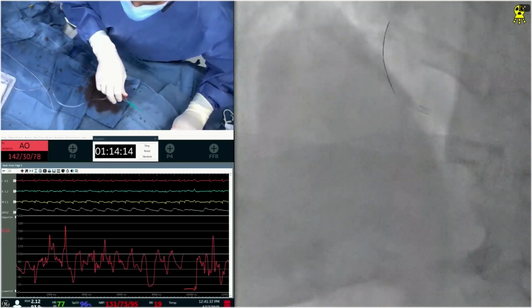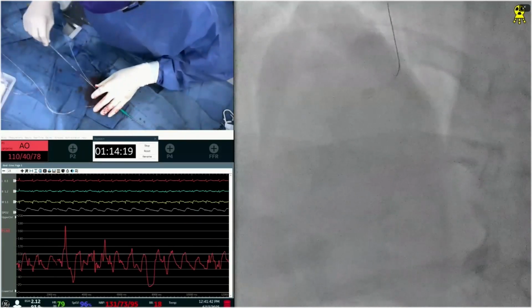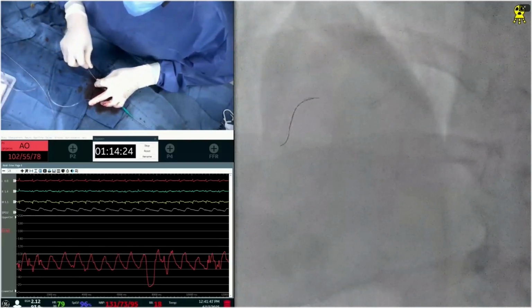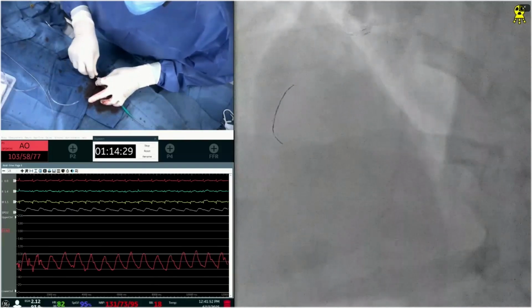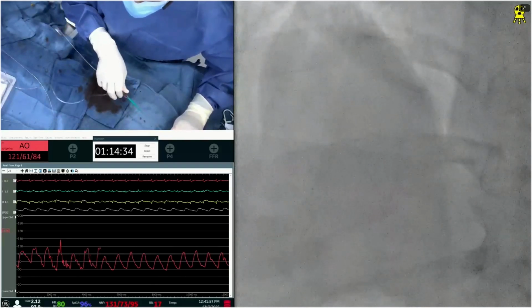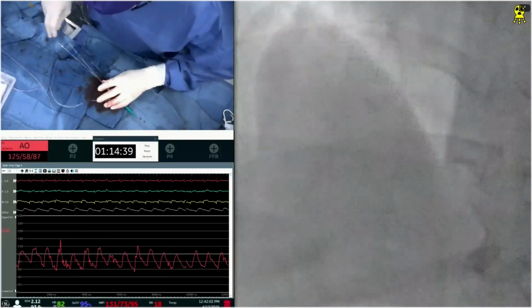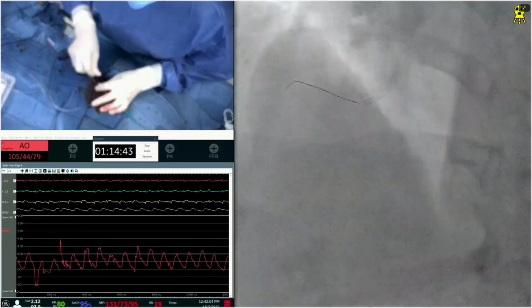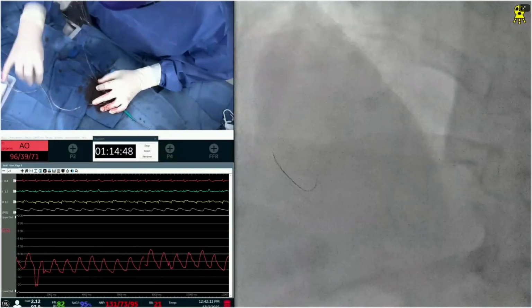Practicing wiring a few times. We already have paid a big price, although we are able to do that case. When these wires come out, anytime you try to move, in these tortuous segments there's a little leeway and they just come out. Look at the tortuosity, see? Little tortuosity and this comes out. Earlier, the first wire was the Fielder and this is the Runthrough wire. So what I'm going to do now, stop at this level. Once it goes to this tortuous segment is the trouble.